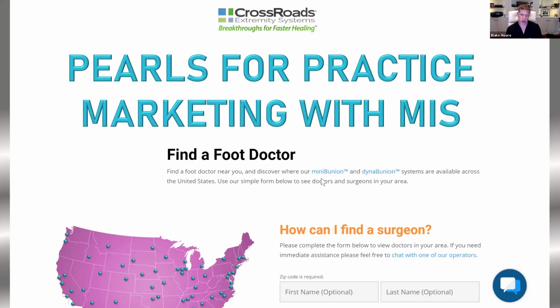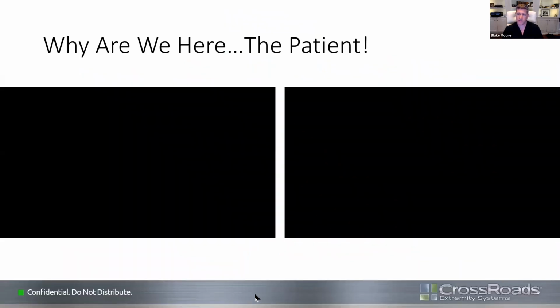Yeah, I've tried it both ways. I've tried with the burr and I've tried it with the bunion blade in the prescribed technique. I think that the burr just creates a lot of heat and a lot of bone debris at that area. That's why all of these burr systems have an irrigation system to try to keep the heat down. And I think that's fine if you're not making any incision at all, to have that heat generation and have the swelling afterwards. But if you're going to make an incision and plate that area, it's really not suitable to use a burr because I just think you're going to have some wound complications. I had a couple very early on, and so I went back to doing the technique as described.